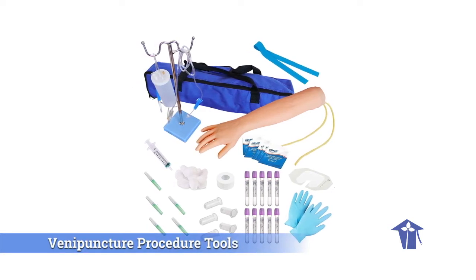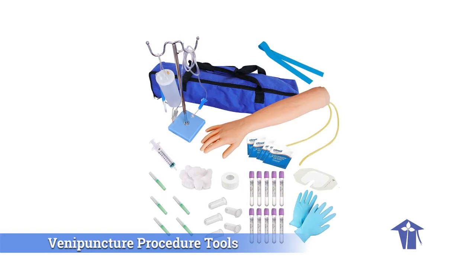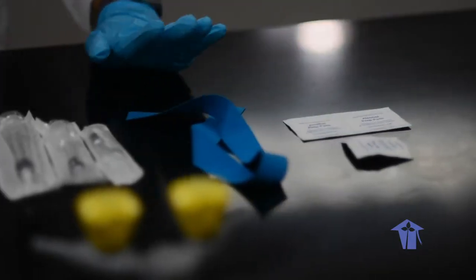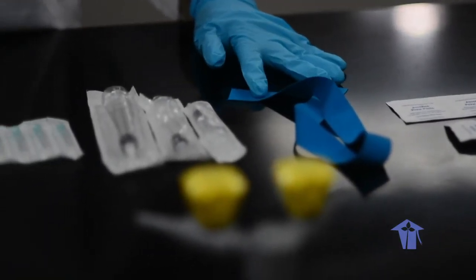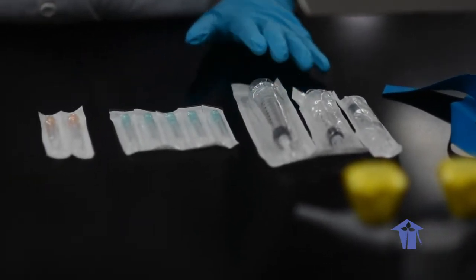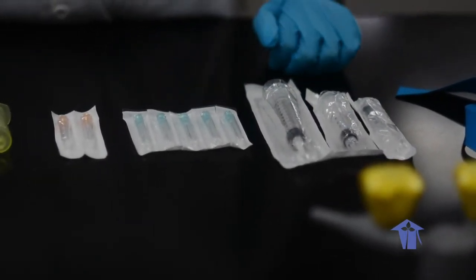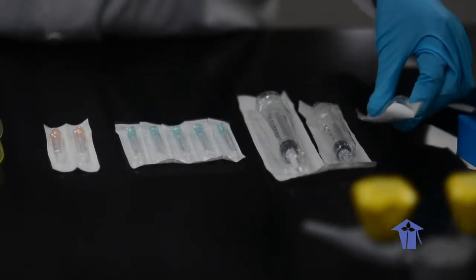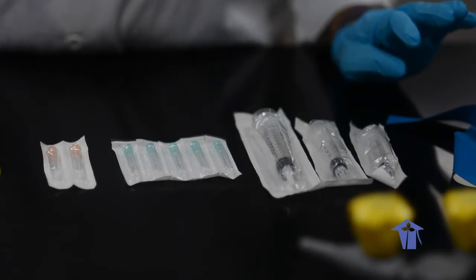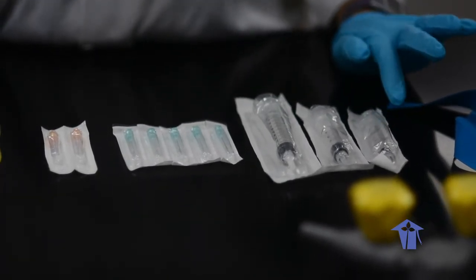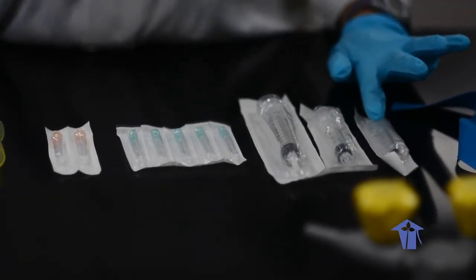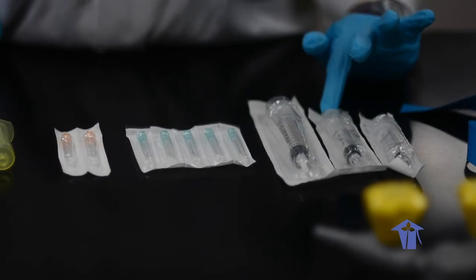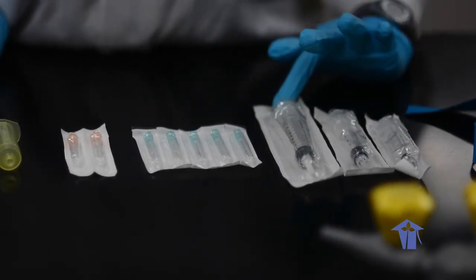So we have the alcohol prep pads. We have a tourniquet. We have, for the syringe method, three sizes of syringe, one that has a capacity of three mls, another five mls, another ten mls.